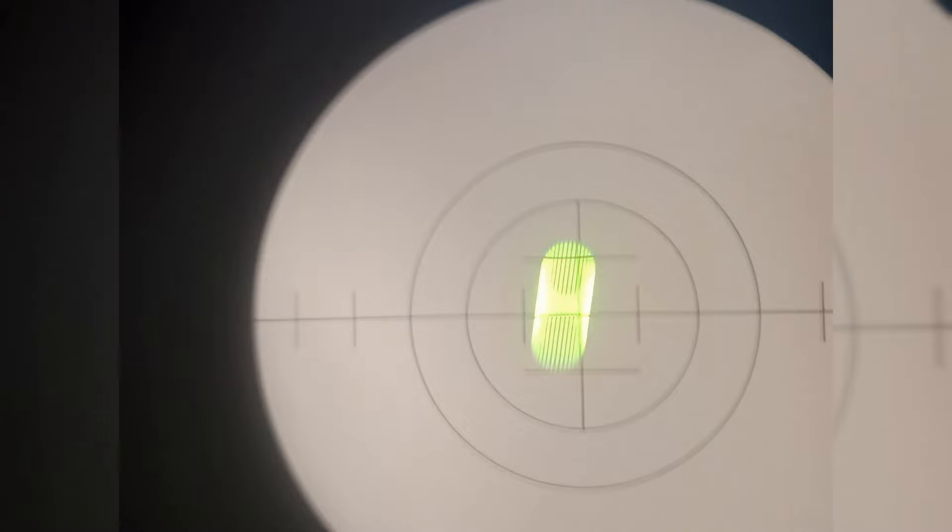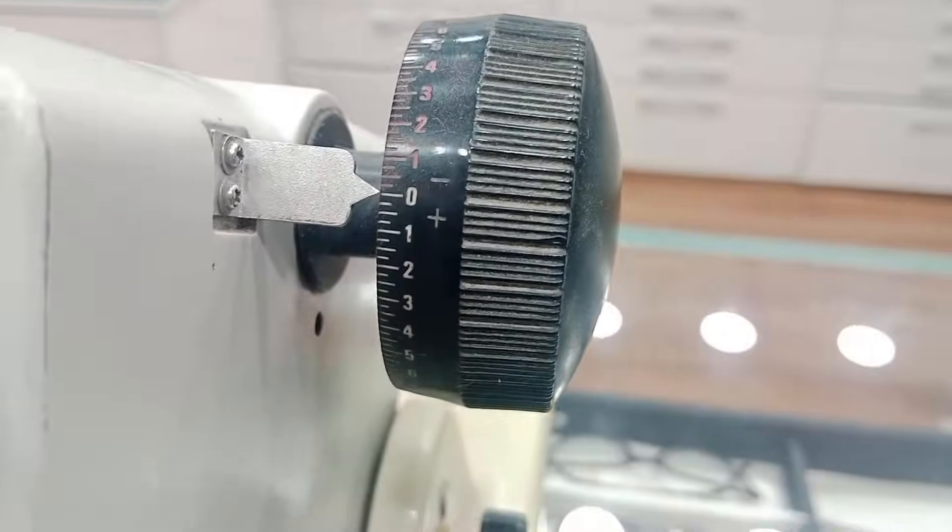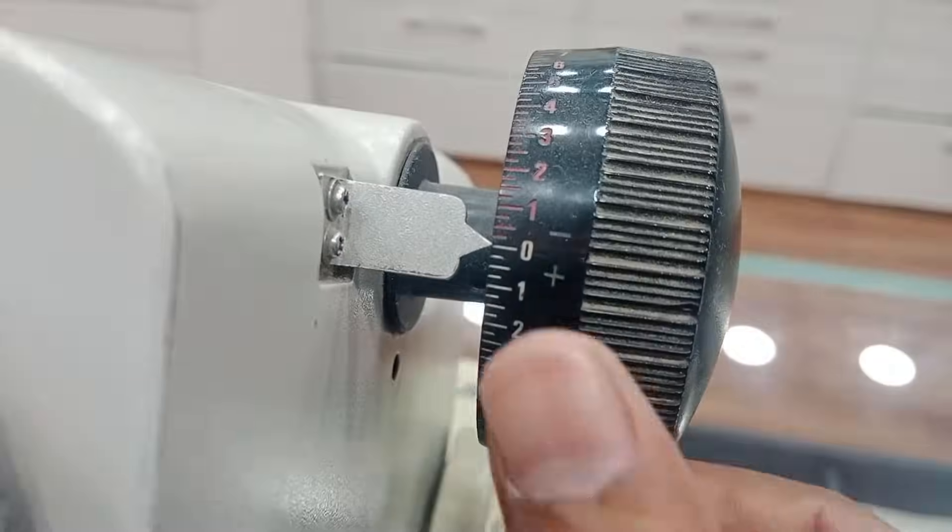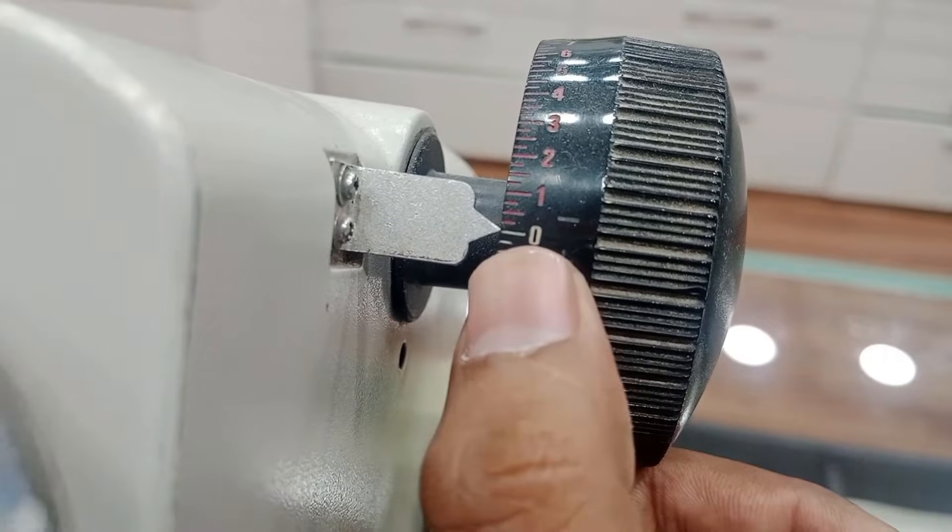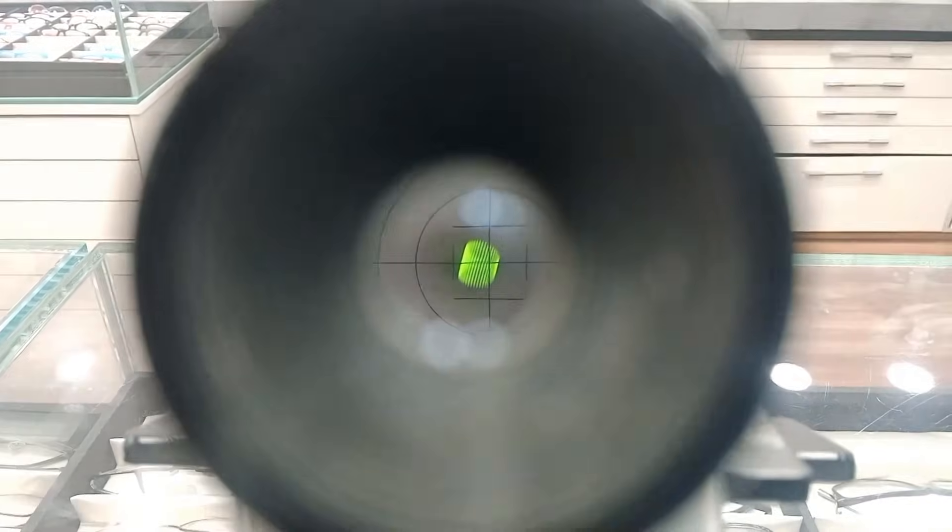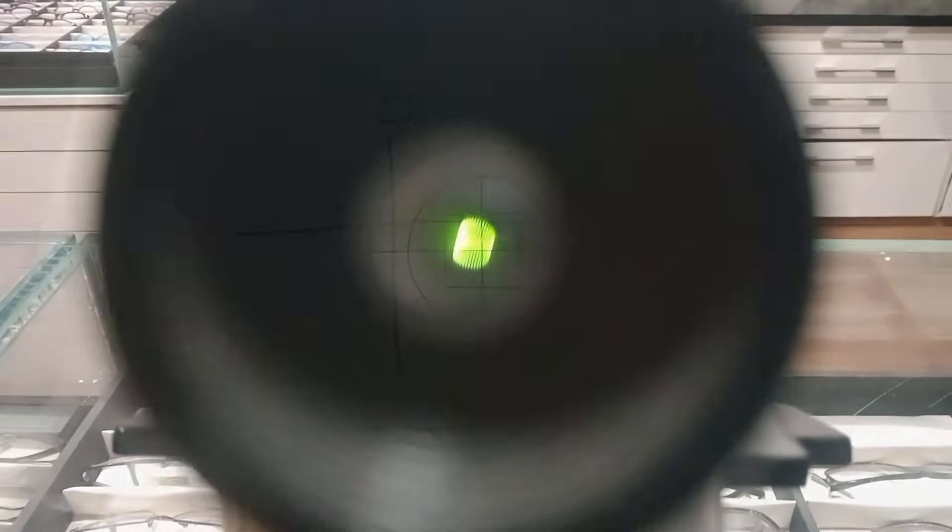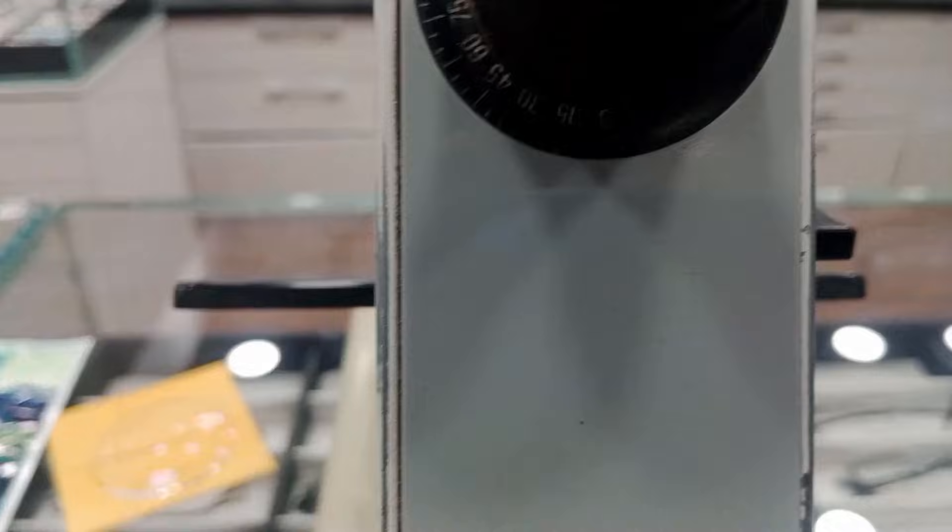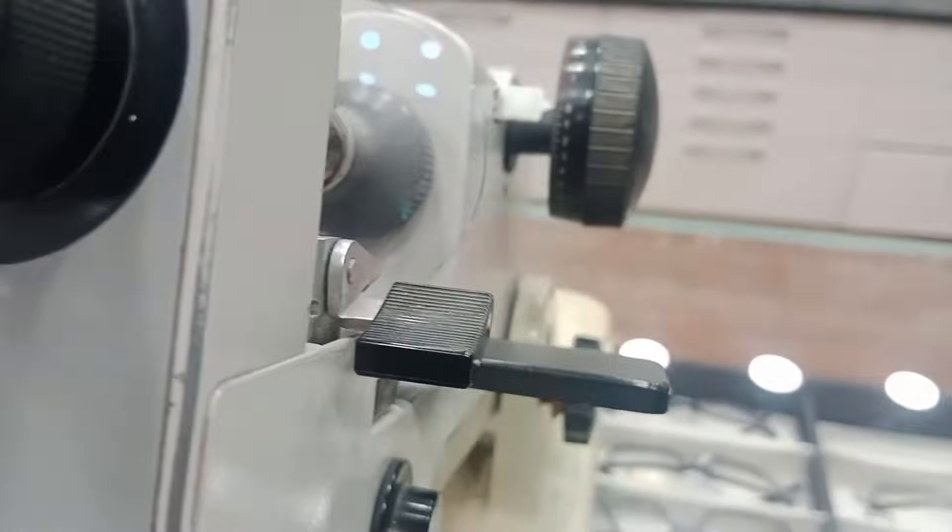So here you can see, this meridian is clear and the meridian is clear at zero. It's totally clear, properly sharp in focus at zero. So our one meridian is clearly focused at zero.